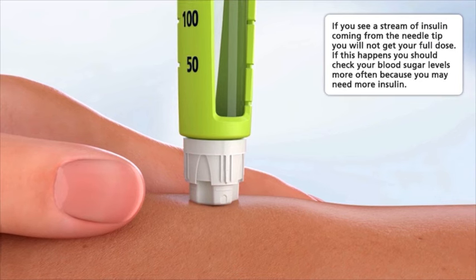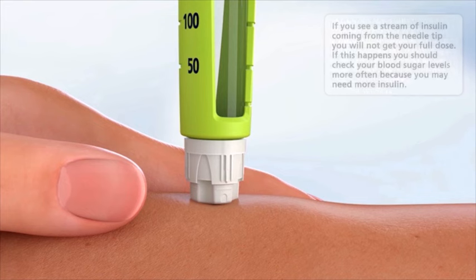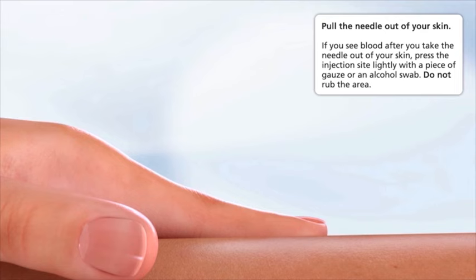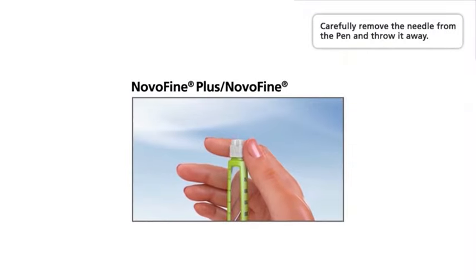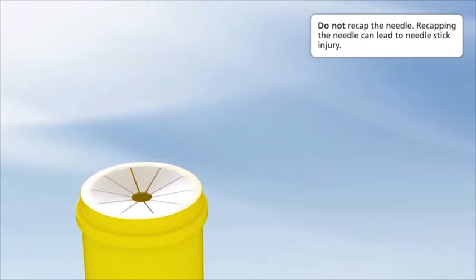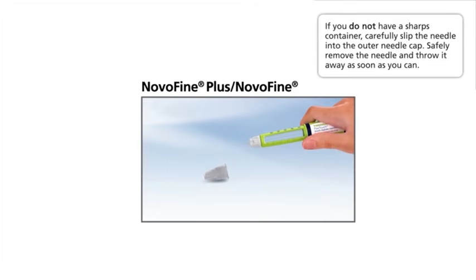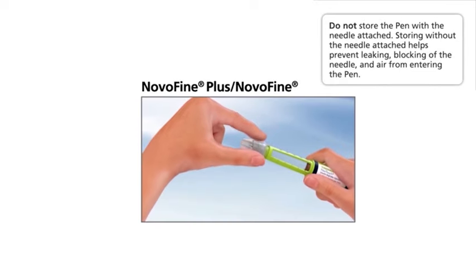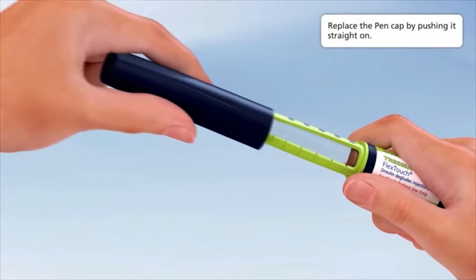When the dose counter returns to zero, you will not get your full dose until six seconds later. If the needle is removed before you count to six, you may see a stream of insulin coming from the needle tip — this means you will not get your full dose, so check your blood sugar levels more often as you may need more insulin. Pull the needle out of your skin. If you see blood, press the injection site lightly with gauze or an alcohol swab — do not rub. Carefully remove the needle from the pen and throw it away. Do not recap the needle, as recapping can lead to needle stick injury. If you do not have a sharps container, carefully slip the needle into the outer needle cap and safely dispose of it as soon as you can. Do not store the pen with the needle attached, as this helps prevent leaking, blocking, and air from entering the pen. Replace the pen cap by pushing it straight on.